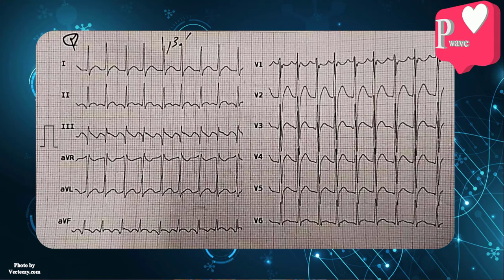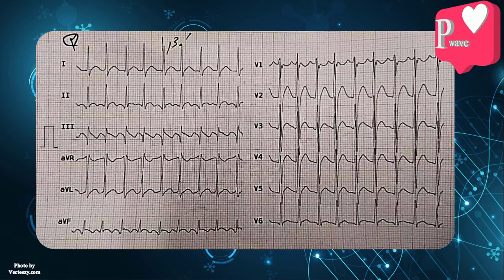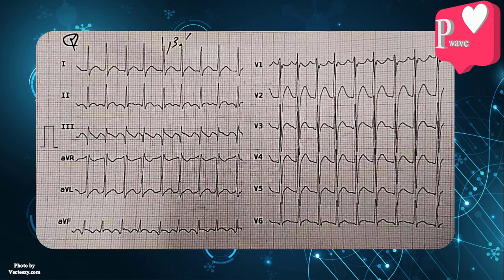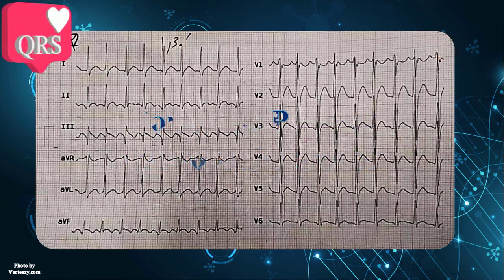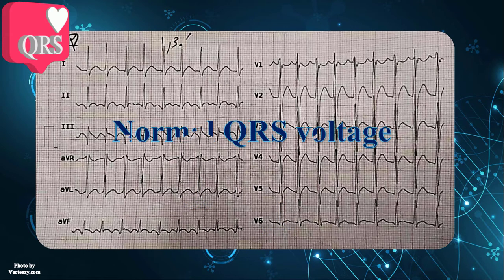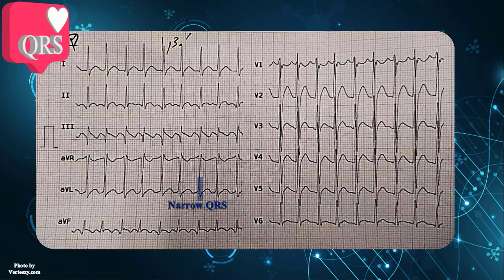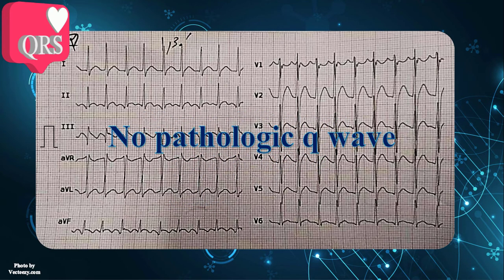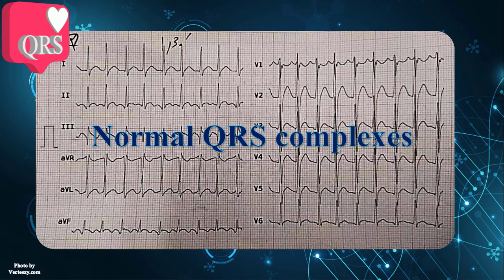Next is wave morphology and intervals. Thanks to atrial flutter, the P waves are inverted in inferior leads and upright in V1. Remember that, without exception, sinus P waves are always expected to be positive in leads 1, 2, and AVF. But here, P waves are inverted in inferior leads and therefore are non-sinus due to the arrhythmia. The amplitude of QRS complexes is greater than 5 mm in limb leads and 10 mm in precordial leads. None of the criteria of ventricular hypertrophy is present, so the complexes are neither low nor high voltage. The QRS complexes are narrow. The transition zone occurs in V4 and therefore is normal. No pathological Q wave is present in this strip. In summary, the QRS complexes have no abnormal changes.